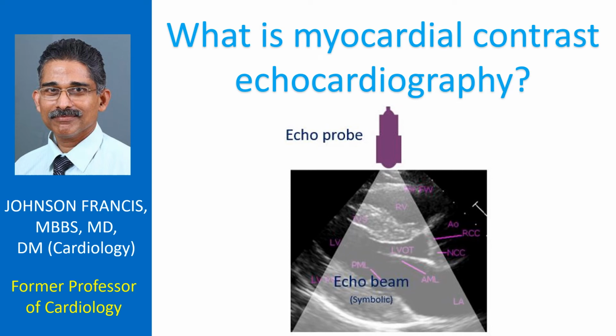Myocardial contrast echocardiography is used for the assessment of myocardial microcirculation and endocardial demarcation. MCE uses gas-filled microbubbles that are inert and remain only within the vascular space. These microbubbles have an intravascular rheology similar to that of red blood cells. A continuous intravenous infusion of microbubbles is given to achieve a steady state.